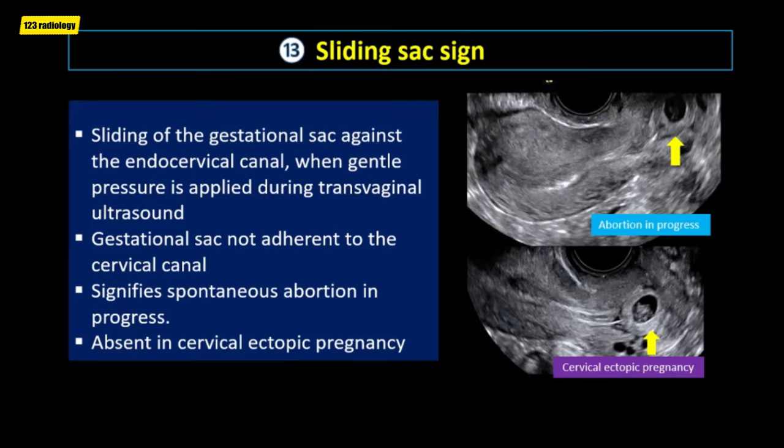The lemon sign represents the loss of the normal convex contour of the frontal bones with flattening or inward depression. It is seen on axial fetal ultrasound images obtained at the biparietal diameter level. It has a strong association with spina bifida and is very useful for detecting this condition before 24 weeks of gestation. The lemon sign may disappear as gestational age advances and is less reliable after 24 weeks.